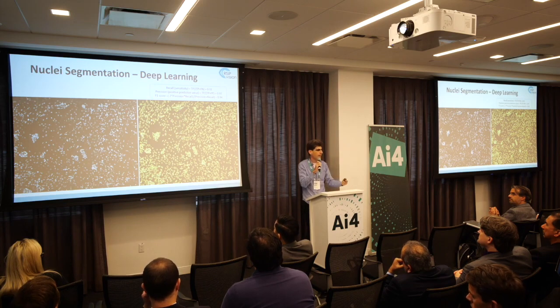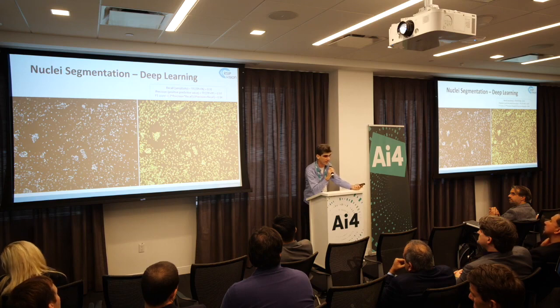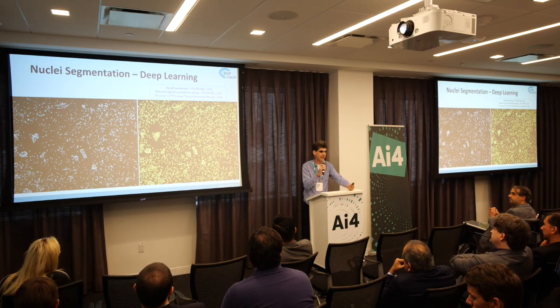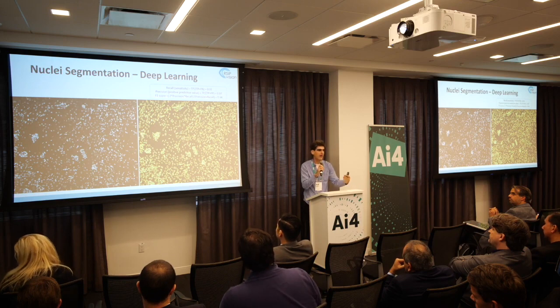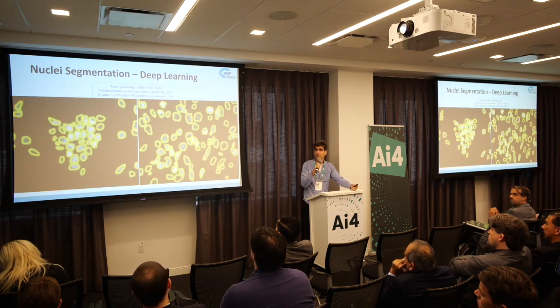Actually, along the way, when you're iterating this, you're doing a training set and a validation set and doing another version of the algorithm, you tend to find lots of errors in the ground truth annotation when you start to look at the network errors. So some of the errors you're going to find when you're developing the solution are really going to be errors of the neural network, and you need to try to get some insight on this. Sometimes you can, and sometimes you can't. Sometimes you say, yeah, I just want more data. Sometimes you have specific failure cases. There are always going to be failure modes in the reverse where you find errors in your annotation thanks to your neural network.